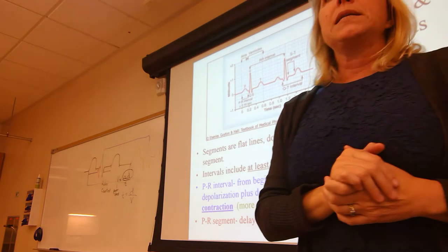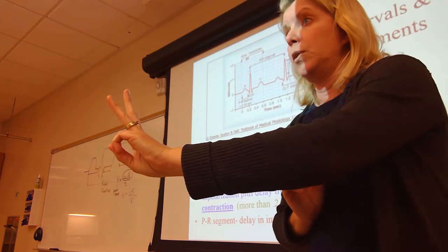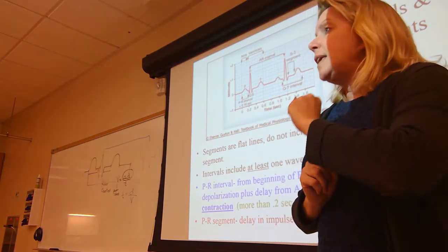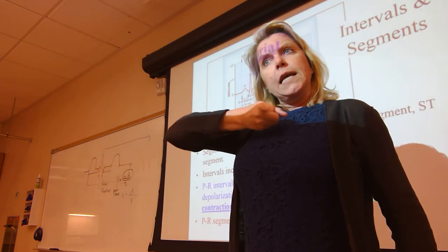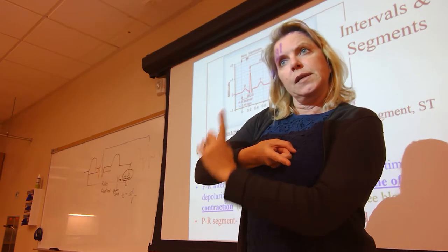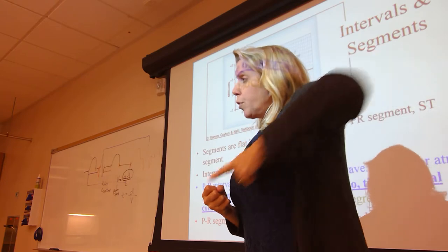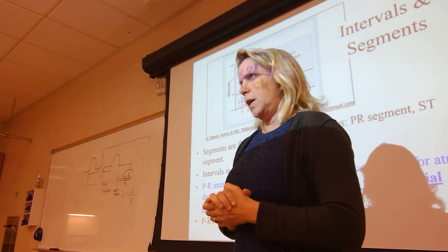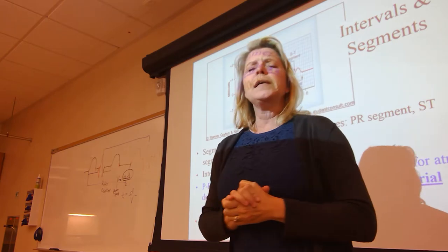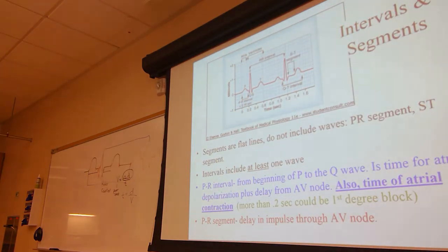Do you remember on Monday I said that there were only 3 combinations that I would use? AVF plus lead 1, lead 2 plus AVL, lead 3 plus AVR. Those were the combinations. That means there's a finite set of appropriate responses to learn.